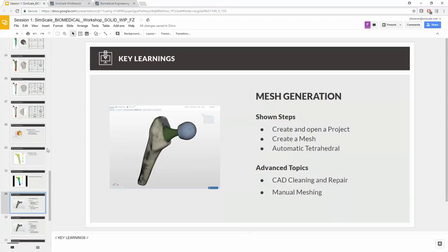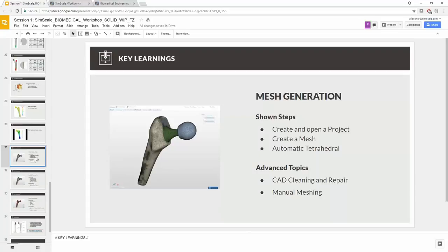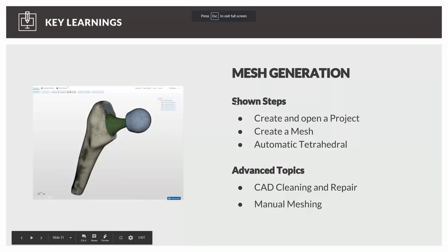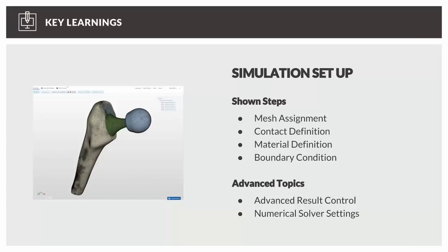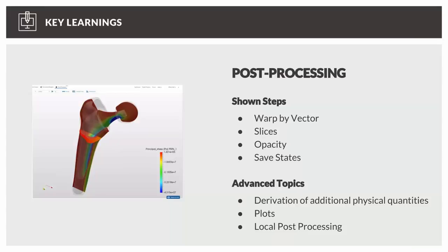That brings us to the key learnings from today's session. We learned how to create a mesh — taking the CAD model and breaking it into tetrahedrons to solve for stresses and strains. The simulation setup involved creating contacts, assigning materials to volumes, and setting boundary conditions. Post-processing included using warp by vector to see hip deformation and a slice to visualize principal stresses acting on the bone and implant.